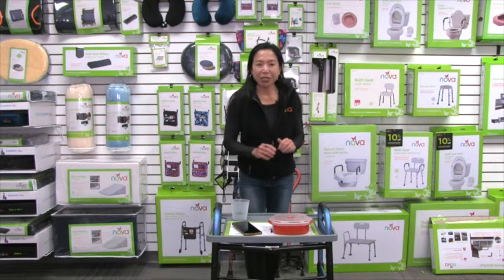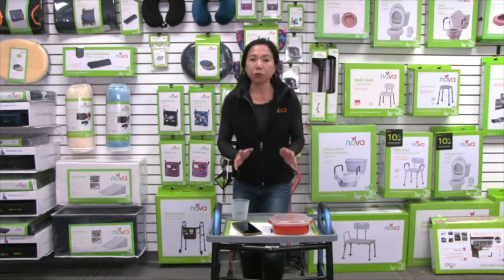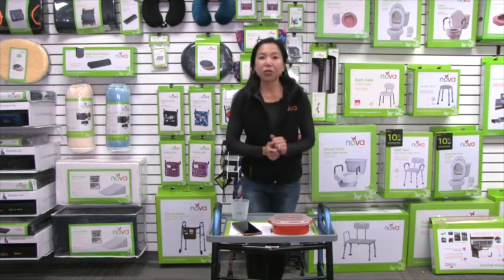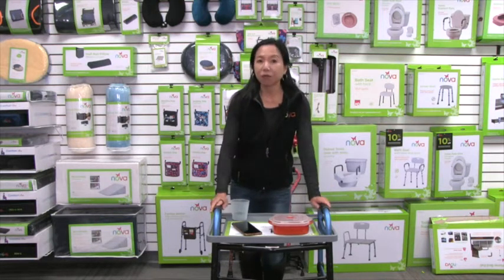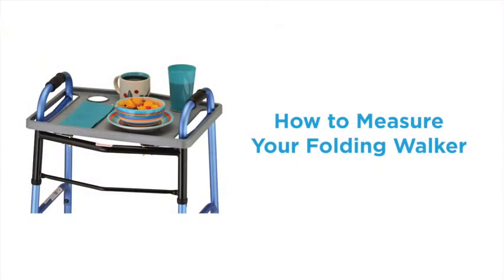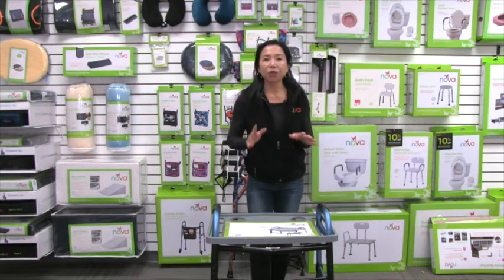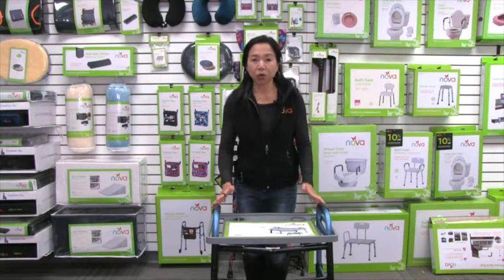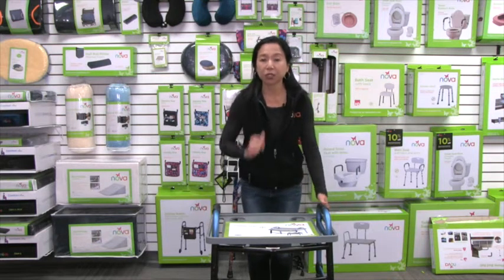Something very important about this food tray is sizing, because it doesn't fit all folding walkers — it fits most. So now I'm going to show you how the food tray fits on your folding walker and how to measure your walker to make sure that this food tray fits.